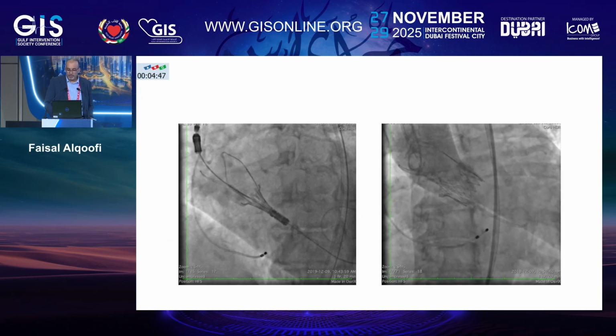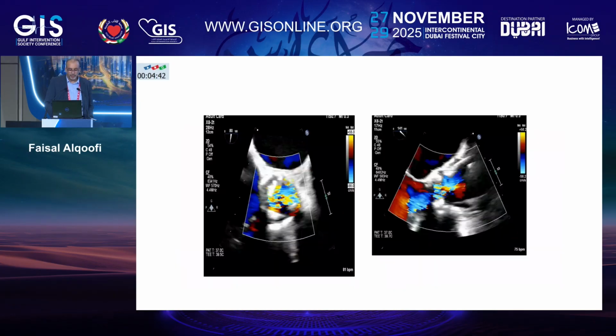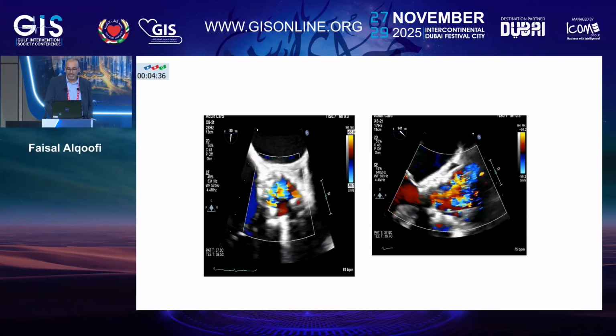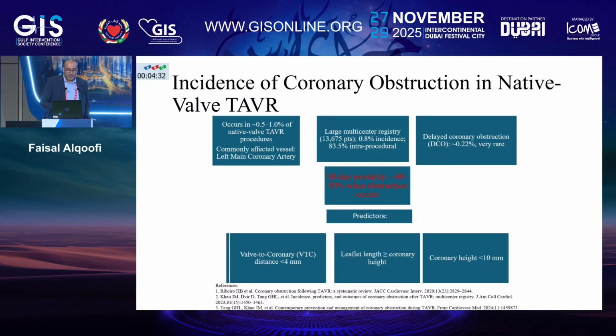The second patient underwent her initial TAVI using an Accurate Neo size 2, and exactly 5 years later, she developed structural valve deterioration manifested as AI. So I will come back to both cases at the end if you add 2 additional minutes to my talk. That's how I can guarantee my additional 2 minutes after the talk.